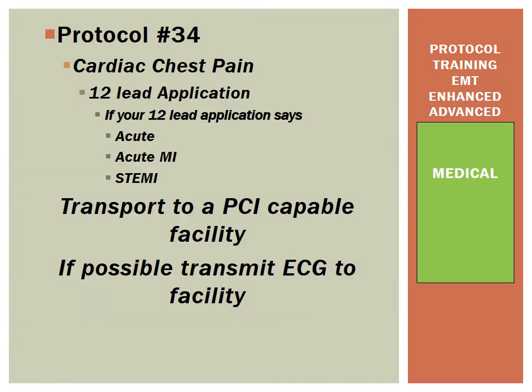Okay, so again, if your 12 lead says acute MI, or it says STEMI in capital letters, transport to a PCI capable facility. And if possible, we need to transmit the ECG to the facility.